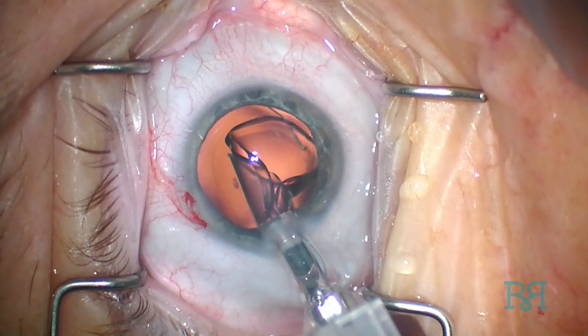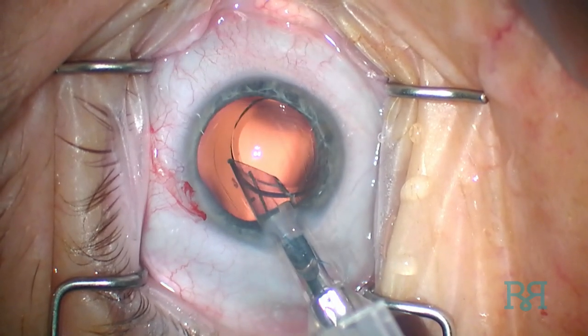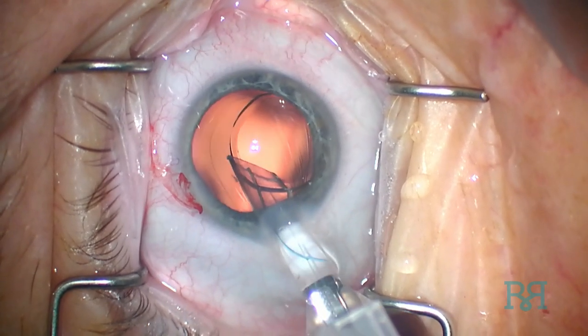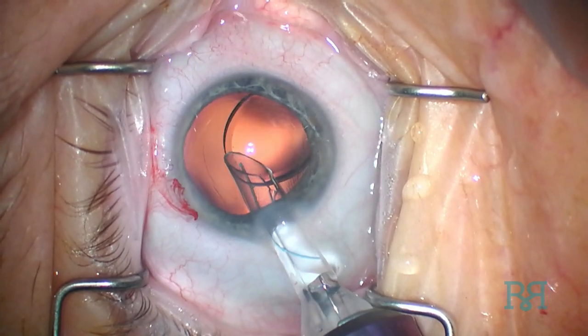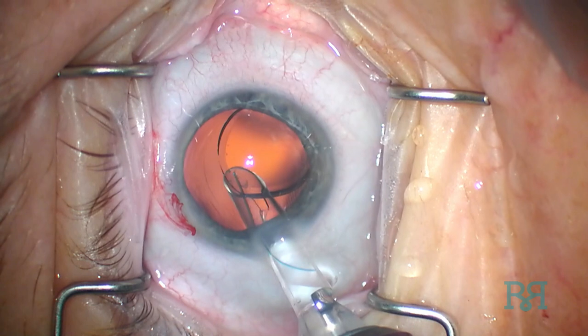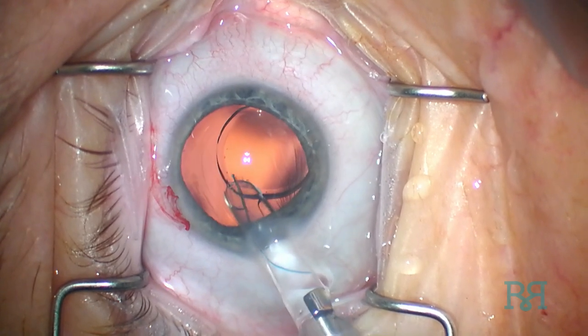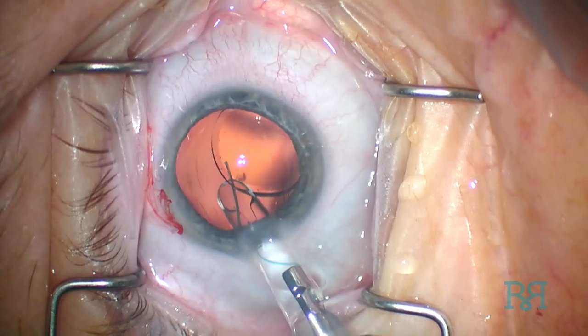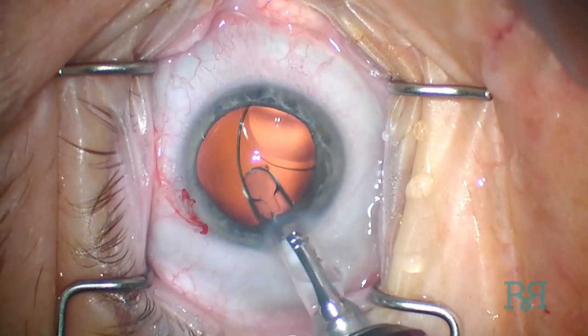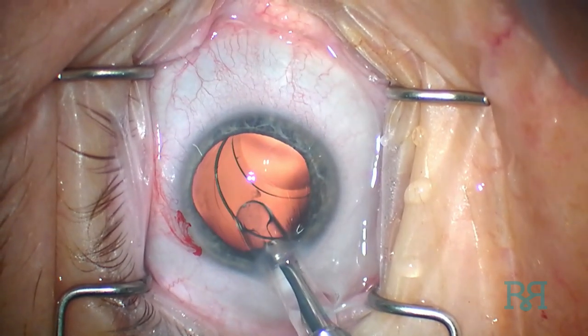The knob is quickly rotated counterclockwise and the entire handpiece is rotated counterclockwise as well, such that the notch is now located in the anterior direction. The knob is then rotated clockwise in order to advance the trailing haptic. If the opening of the inserter is still in the capsular bag, the trailing haptic will also fall into the capsular bag.